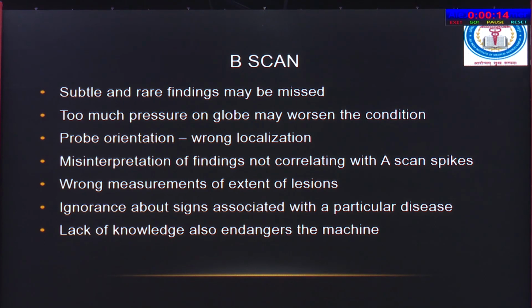For example, in cases of orbital cysticercosis, they might miss a few findings. So lack of knowledge also endangers the machine. This also has to be kept in mind. The probe itself is very expensive.